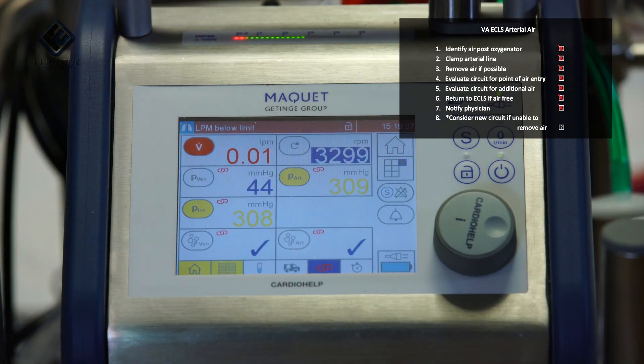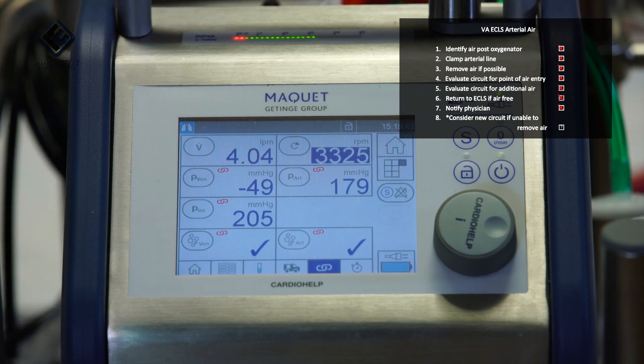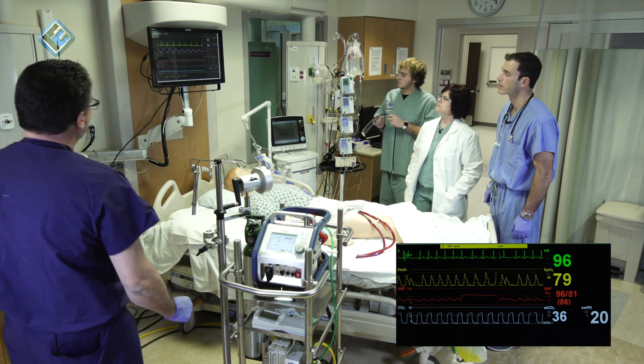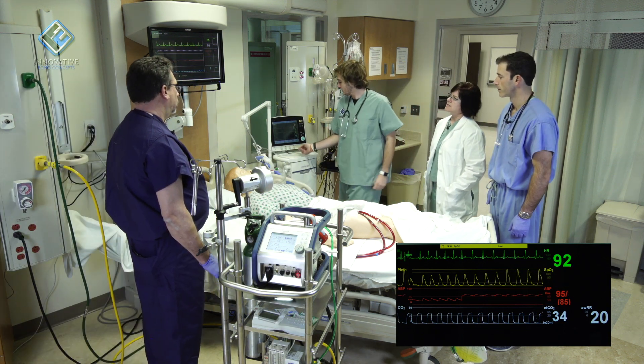I'm going to take the arterial clamp off. We're back at full flow. Can you please return the patient to the rest of the ventilator settings? Certainly.